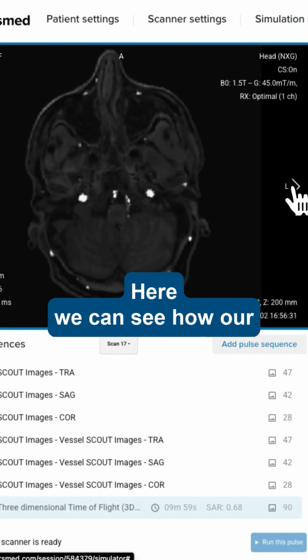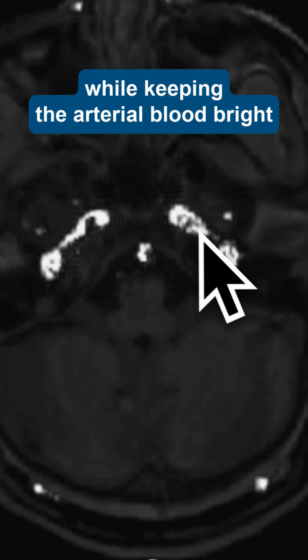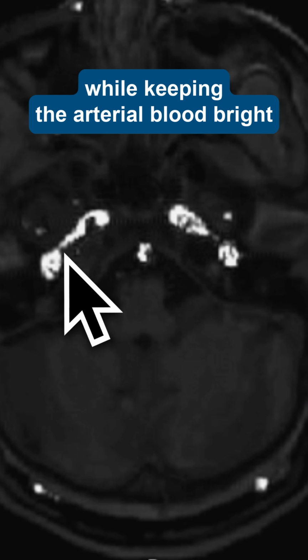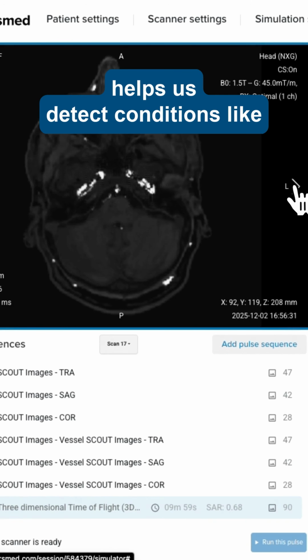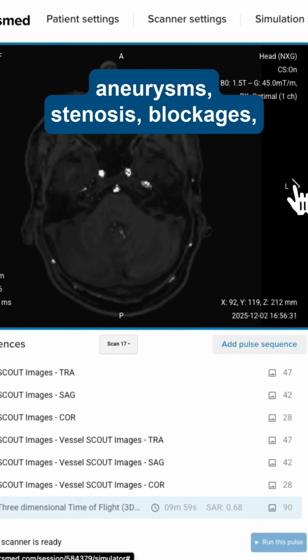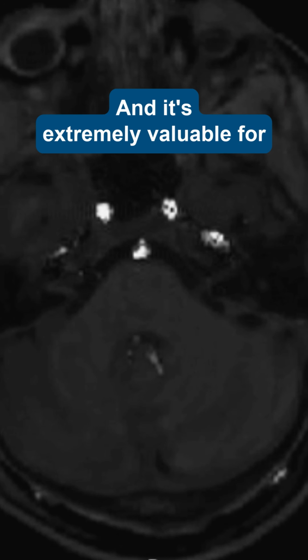Excellent. Here we can see how our acquisition suppressed the background tissue very well while keeping the arterial blood bright. This non-contrast acquisition helps us detect conditions like aneurysms, stenosis, blockages, and arterial thrombosis and malformations, and it's extremely valuable for exploring the brain's arterial system.